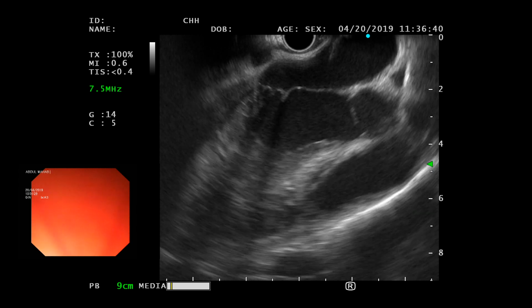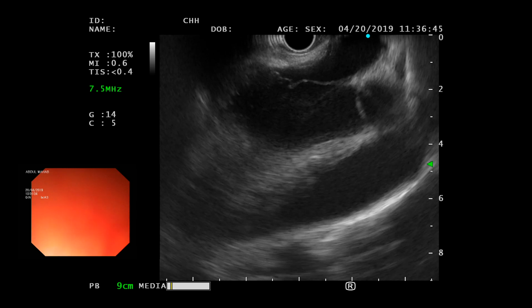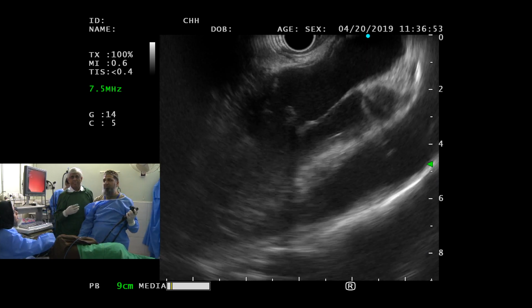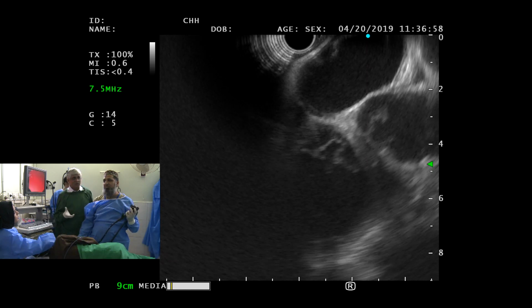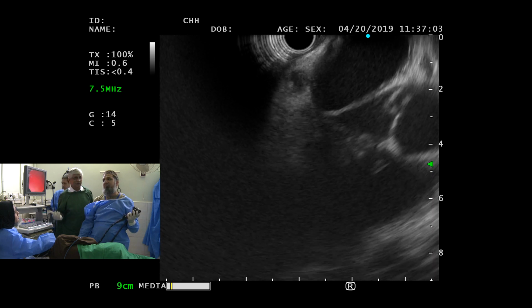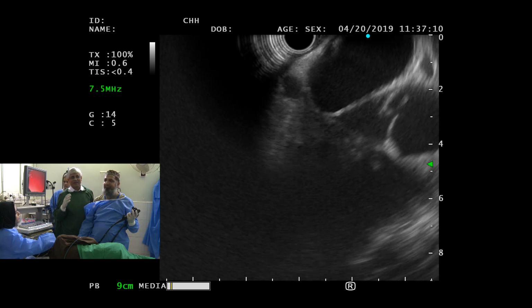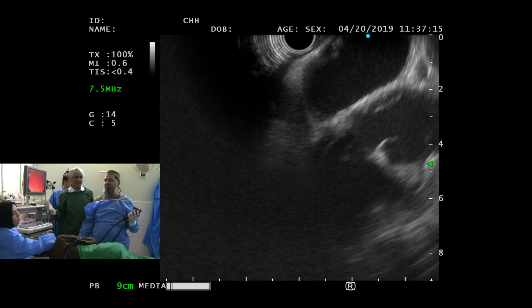Okay. So the objective here was instrument intubation, reaching the D2, scope handling, then going into the stomach and identifying structures, and going to D1, identifying the portal vein, CBD, or whatever is one of the major structures there, and then following them clockwise, anti-clockwise, and then going into D2, and then identifying the aorta, inferior vena cava, and then finding the uncinate.